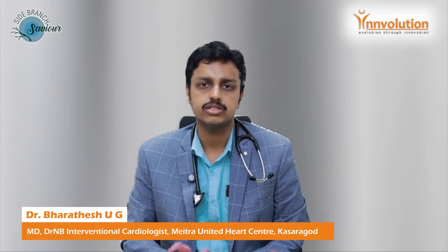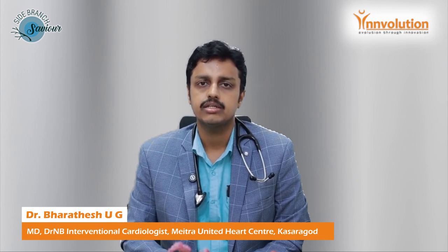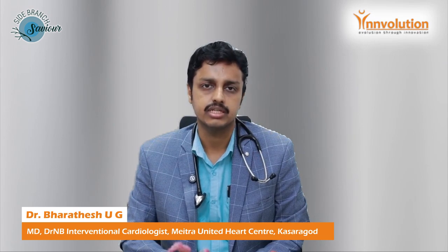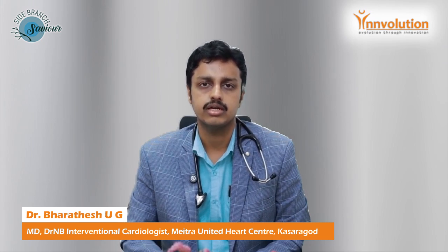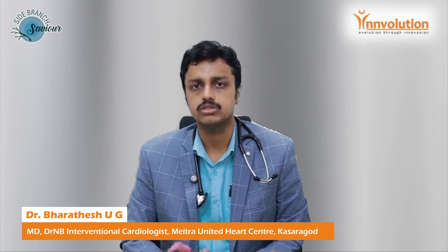We may require a larger population to study the rate of stent restenosis or thrombosis in side branch cases, maybe 5,000 to 10,000 cases in a hospital study, and we may have to do a repeat angiogram after 1 or 2 years to look for restenosis chances or recoil chances. That is more important to know the restenosis chances.